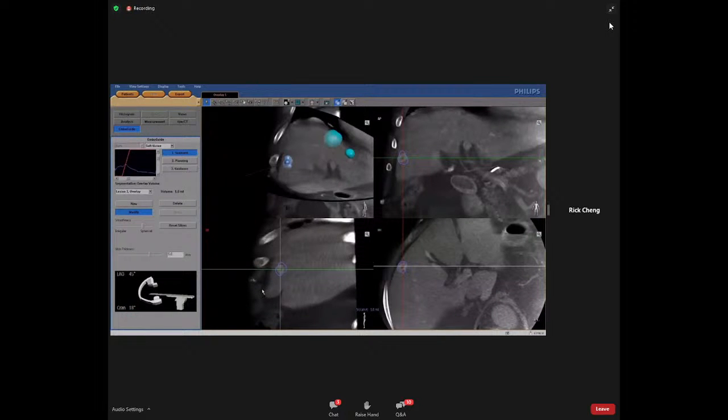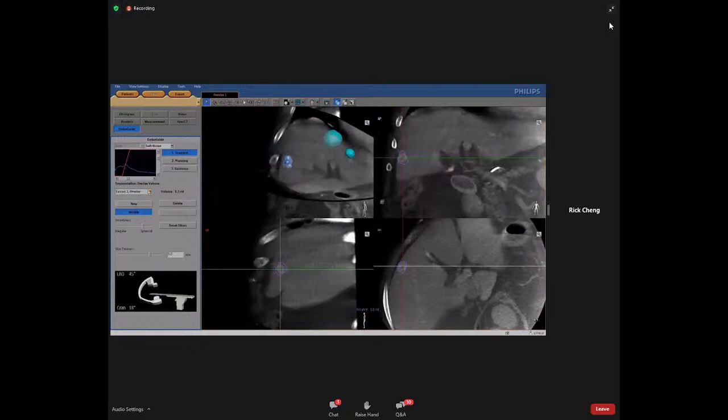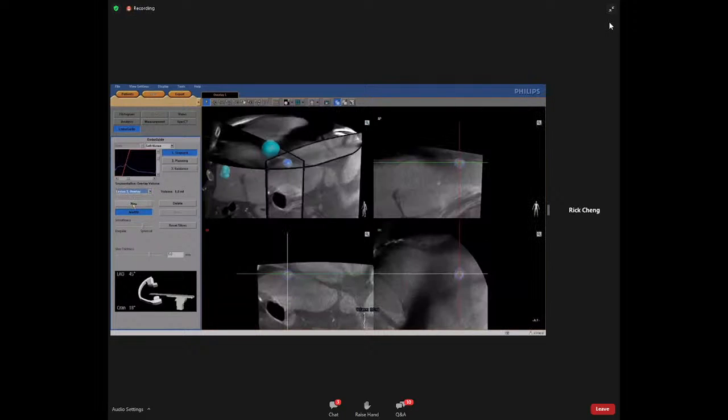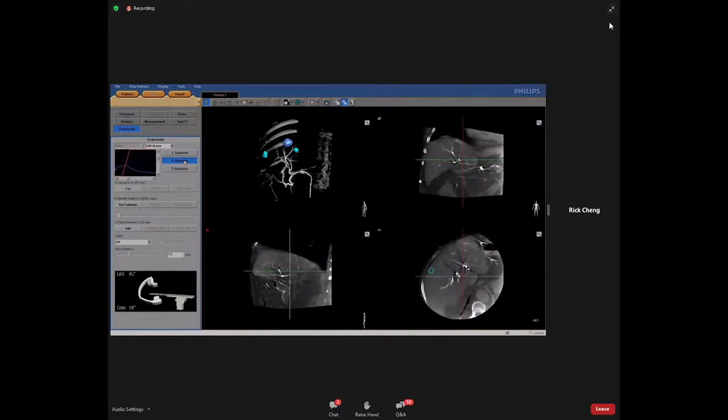Scroll through the cone beam CT volume to check if all regions are segmented properly. It's a good idea to check the segmentation in all the different planes. Zoom in on the lesions and check if they are properly covered by selecting a single lesion. When all lesions are identified, proceed to the planning step.